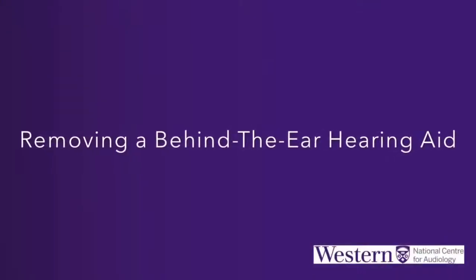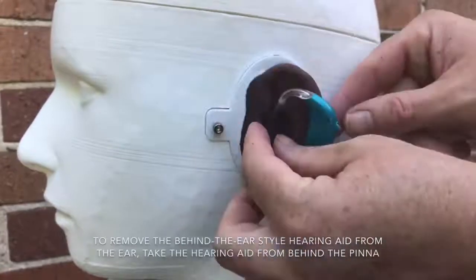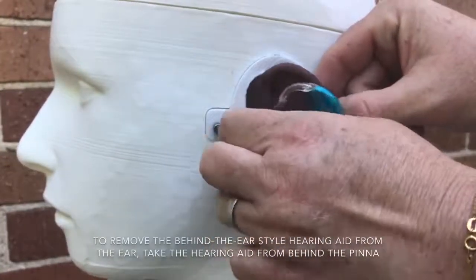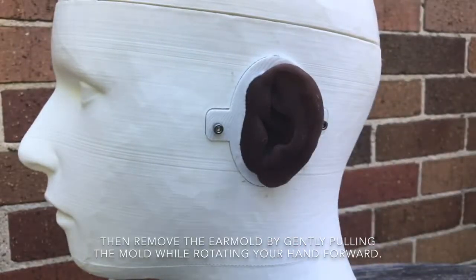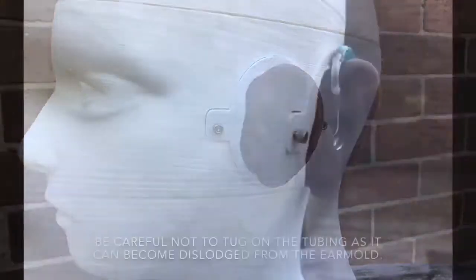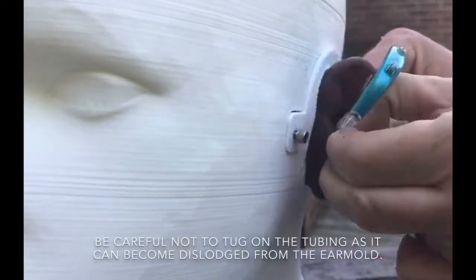To remove the Behind the Ear style hearing aid from the ear, take the hearing aid from behind the pinna, then remove the ear mold by gently pulling the mold while rotating your hand forward. Be careful not to tug on the tubing, as it can become dislodged from the ear mold.